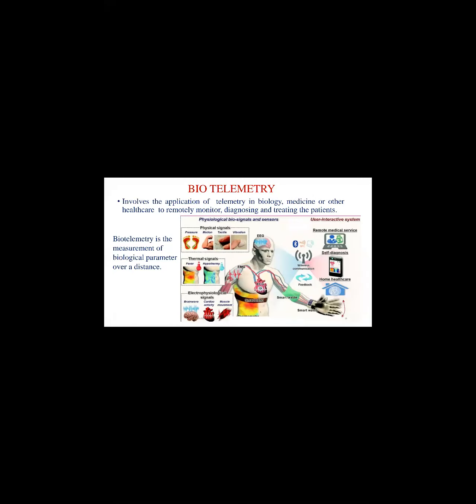First, we have to consider biotelemetry applications. Biotelemetry is mainly used for measuring biological parameters over a particular distance. Biotelemetry is the transmission of measured information or parameters of the patient to an external device, or vice versa, from the external device to the patient. That's why we use uplink and downlink data telemetry systems. Here we have two types of data telemetry, active telemetry and passive telemetry. In active telemetry, you have effective data transfer in both directions, from external devices to the patient and from the patient to external devices, over a long distance.